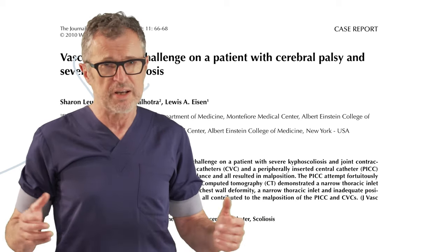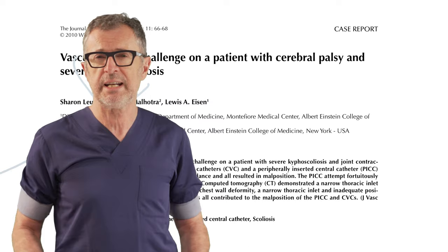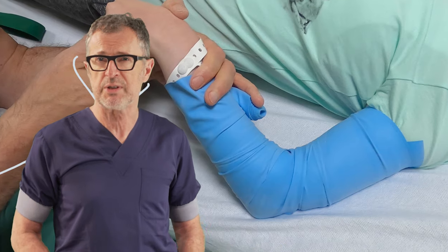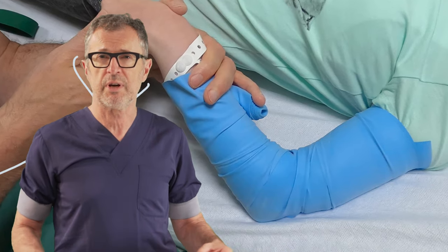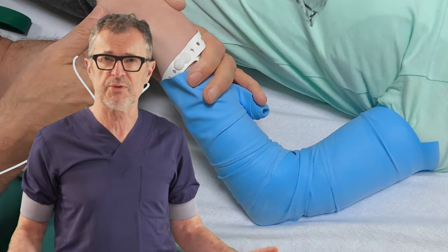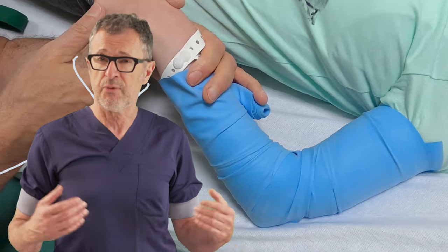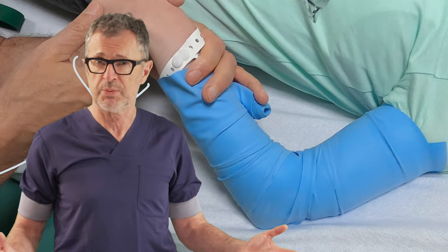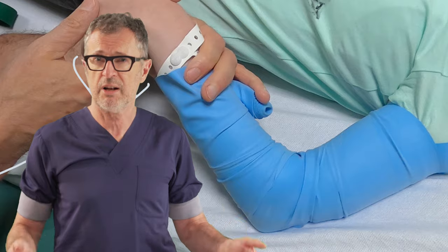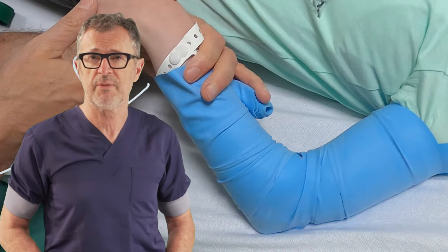So here's one technique that I oftentimes use in patients with cerebral palsy — how you can distract them and facilitate obtaining an IV access. Let's watch this video.